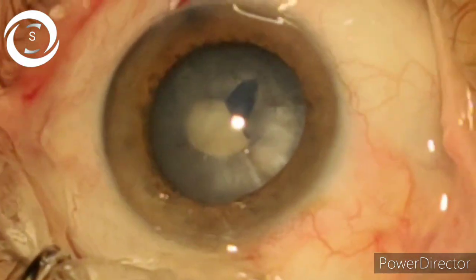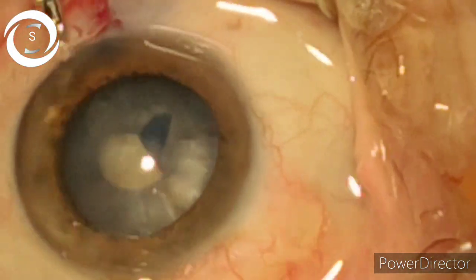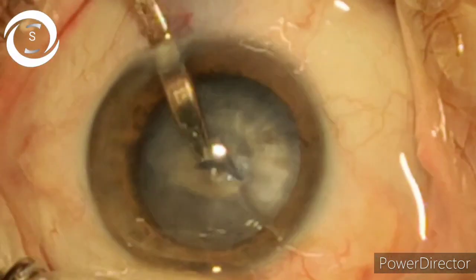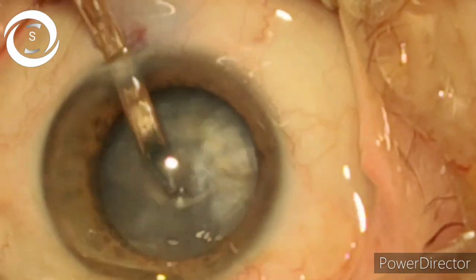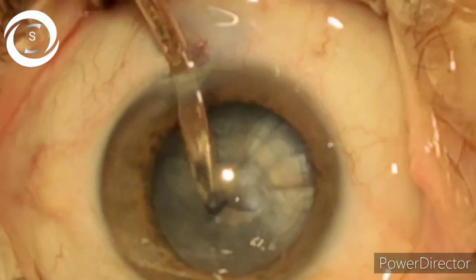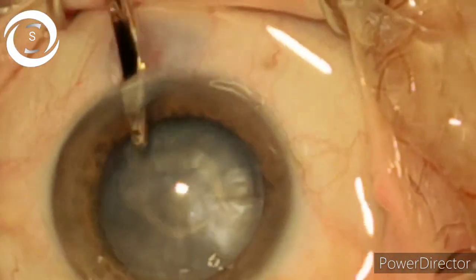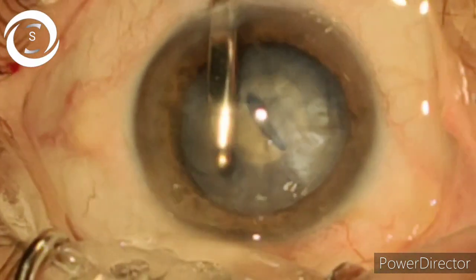Put an irrigation-aspiration cannula and aspirate the anterior cortical matter to deflate the capsular bag, because this will decrease the intracapsular pressure. You can see here — don't manipulate too much; slowly and gently remove an adequate amount of the anterior cortical matter.